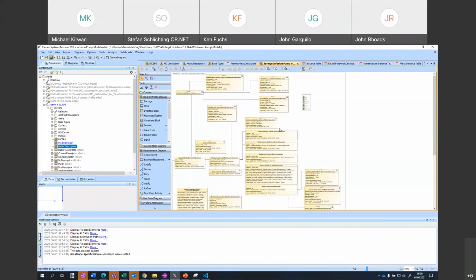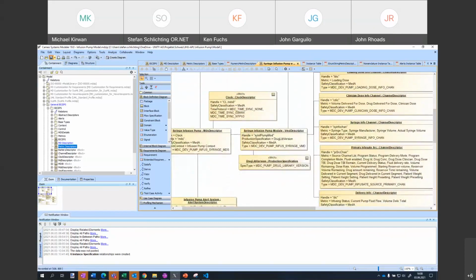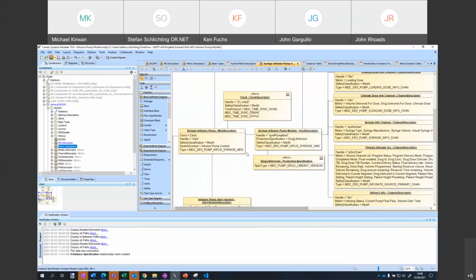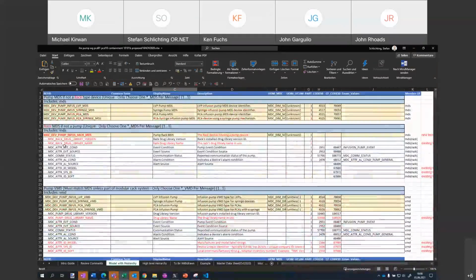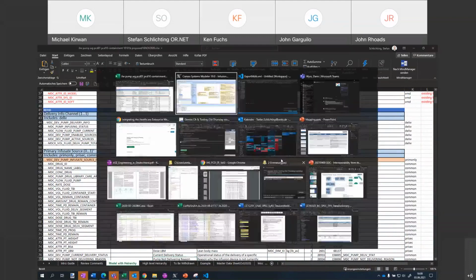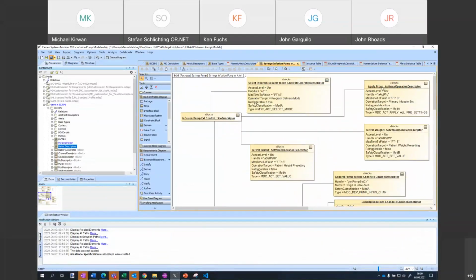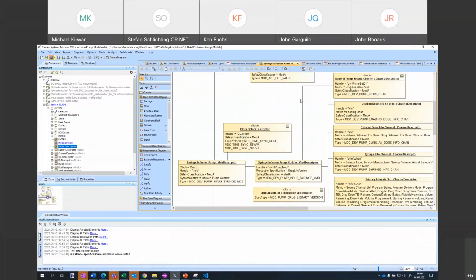What we did over the last, I don't know, 6 months or something like that, is we created an instantiation of this BICEPS meta model, which is typed for a syringe infusion pump. And what we used for that purpose is the great work from the infusion pump group, where they already defined an outline, a structure, of how such a model could look for HL7 version 2 or IEEE messages. We took this work and converted it into this BICEPS instantiation. Of course, we had to remodel something because the methodology or the transport or the domain model is a little bit different.